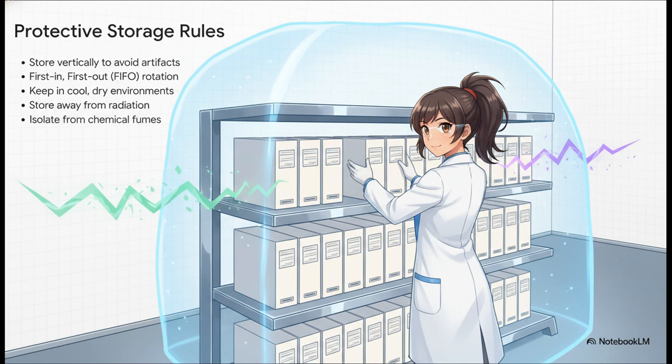Boxes absolutely must be stored vertically. Stacking them flat creates pressure artifacts that can actually mimic patient pathology. You've got to rotate stock strictly, first in, first out. Keep the film cool, dry, and entirely isolated from radiation and darkroom chemical fumes, which can slowly fog the film before it ever even sees a patient.